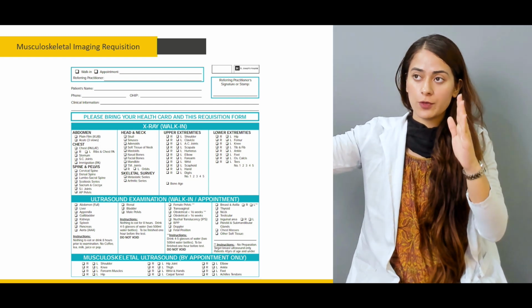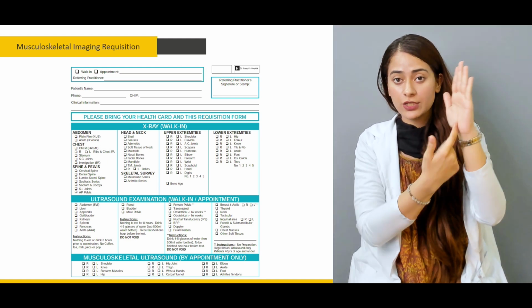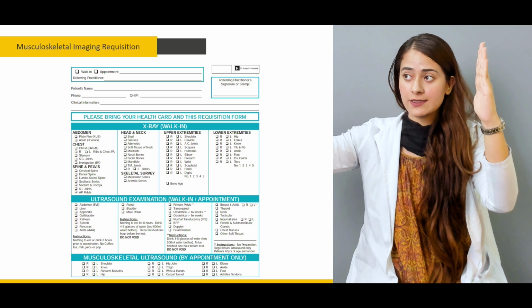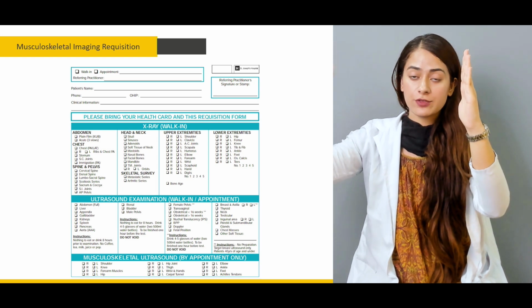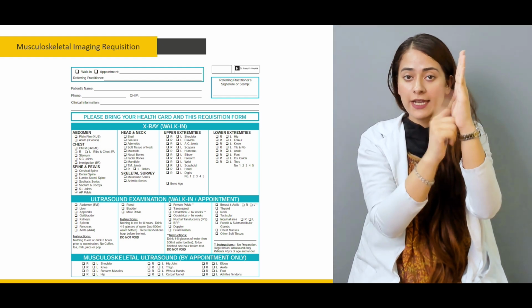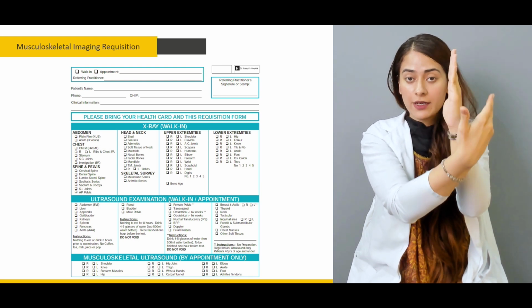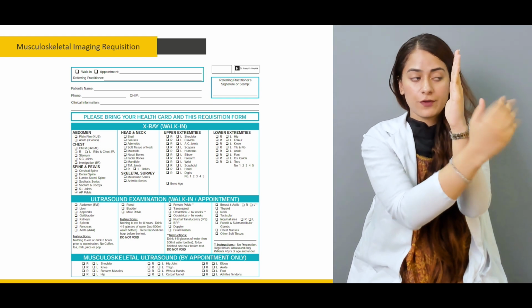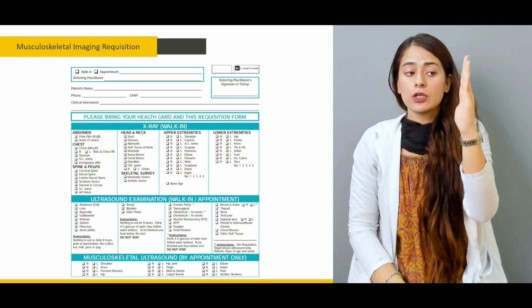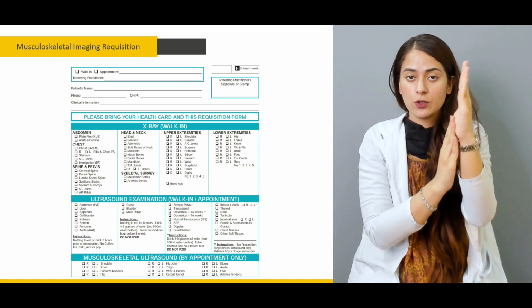If the X-rays are coming from this direction, and this is my anatomical position, and I am facing towards the X-ray generating site, then the X-rays will fall on this anterior surface, exit the posterior surface of my hand or any body part being viewed, and fall on the bucky or the cassette, which will form the radiograph. So this will become the anterior posterior view, the AP view.